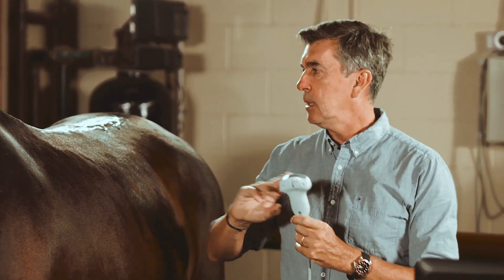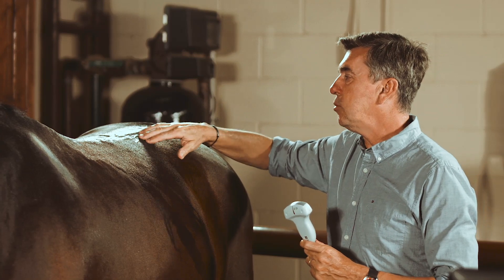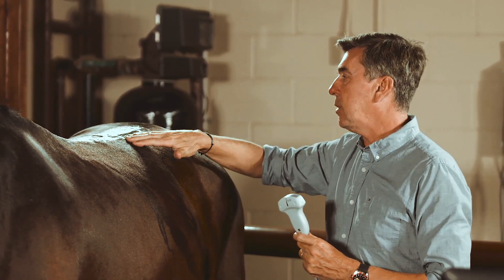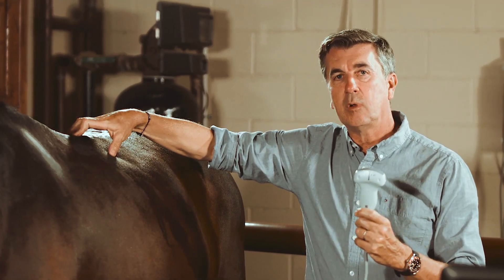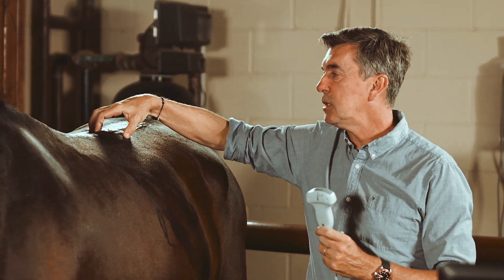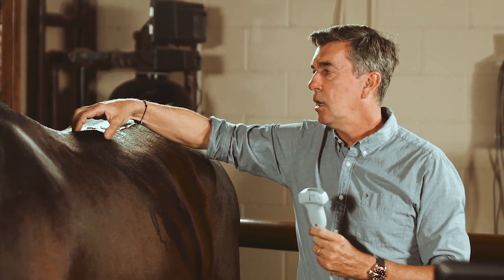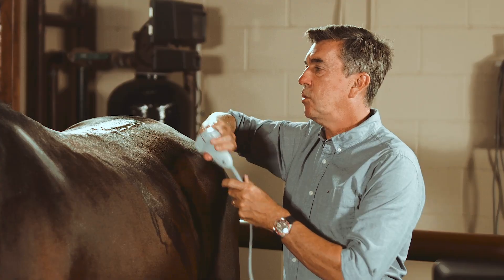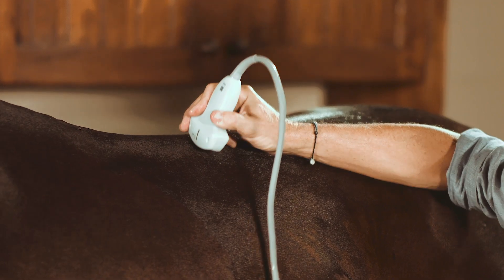This two-to-five megahertz probe is going to allow us to look at deeper structures of the back. We are looking at the longissimus muscle on each side, and the gluteus muscle starting at the level of the lumbar spine. The other structure of great interest is evaluating the facets of each articular process — also called apophyseal articular processes — of each vertebra. Per vertebra, we have one cranial facet and one caudal facet, or apophyseal joint.